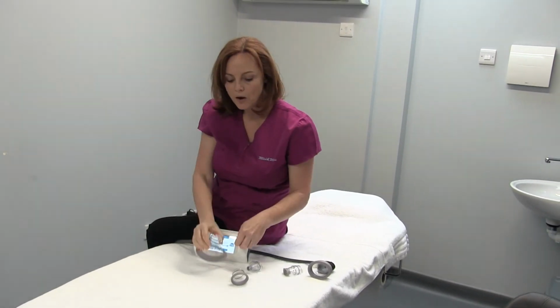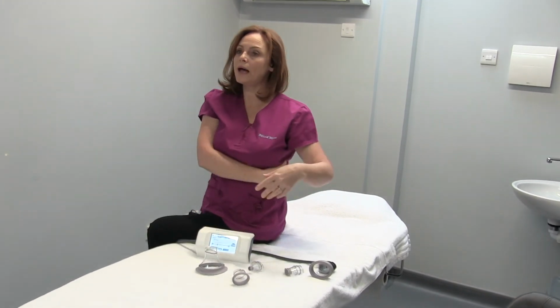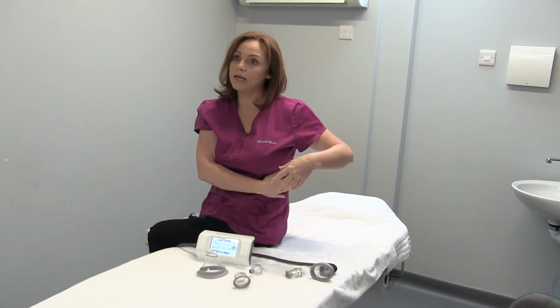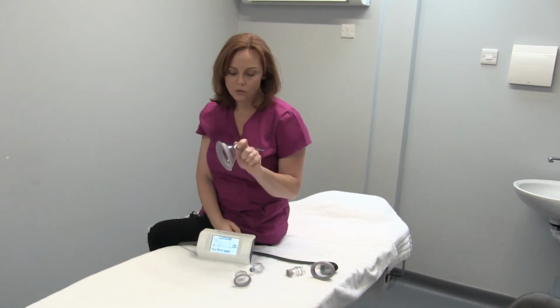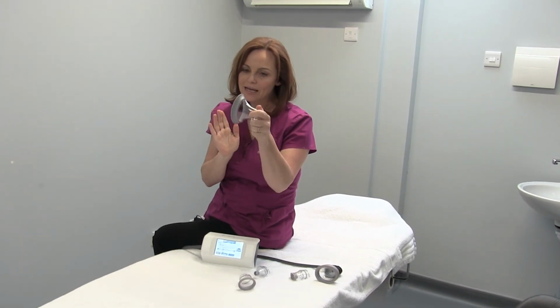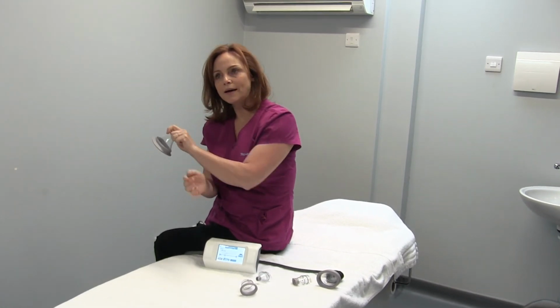When I turn my patients on the side, quite often they have swelling, lymphedema in this pathway here. And again, this is so effective in being able to just pull up the area and slide it right across the watershed to the other side.